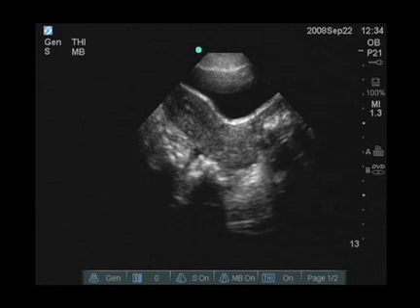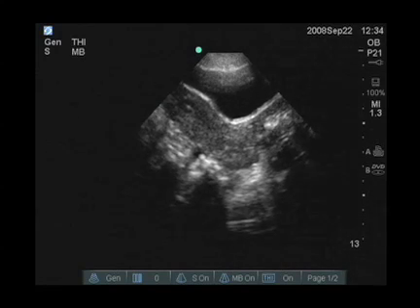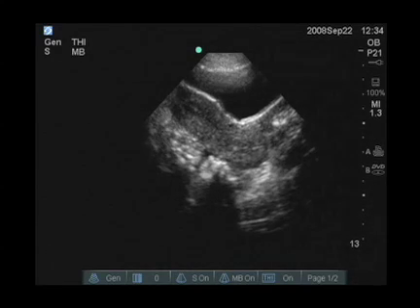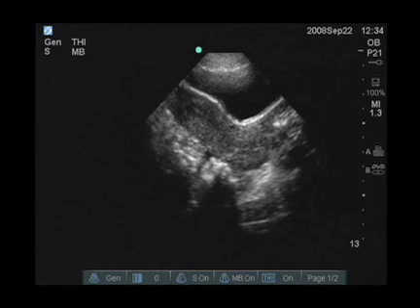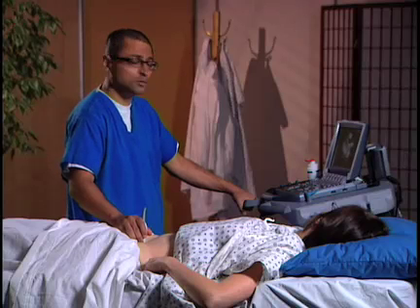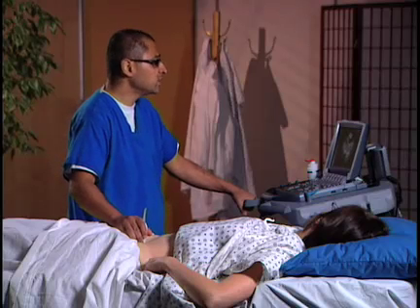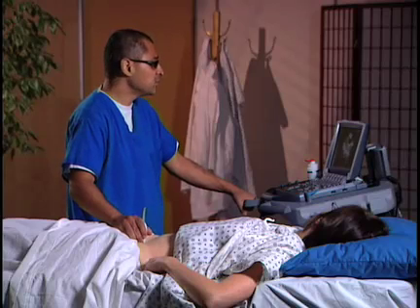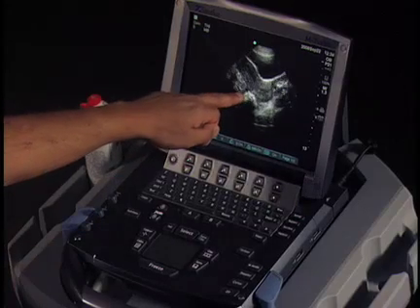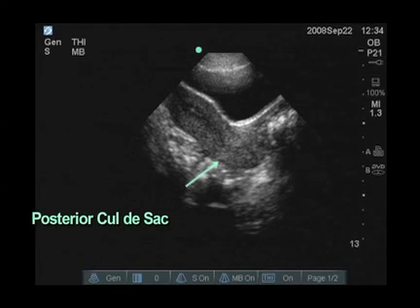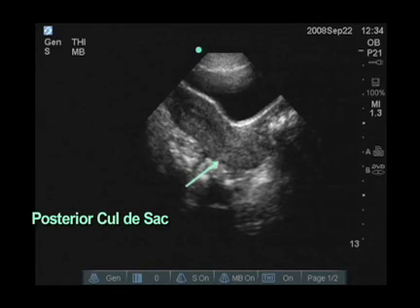The first sign of a developing pregnancy is a gestational sac. We're going to look for a gestational sac, and the next subsequent signs would be a yolk sac or a fetal pole — again, these would be located in the mid-uterine position. Other areas we're going to carefully examine would be the cul-de-sac, which would be just posterior to the uterus, where we're going to look for free fluid.